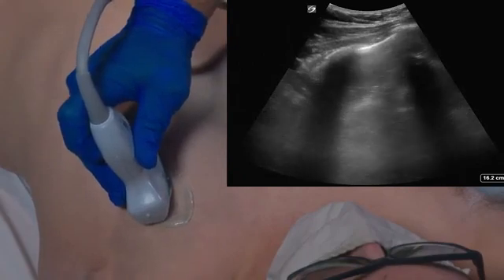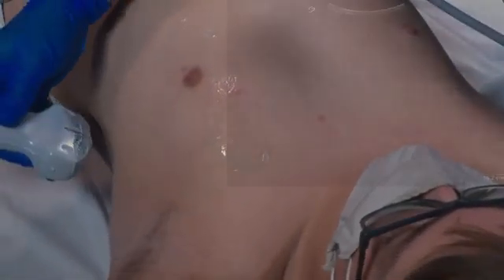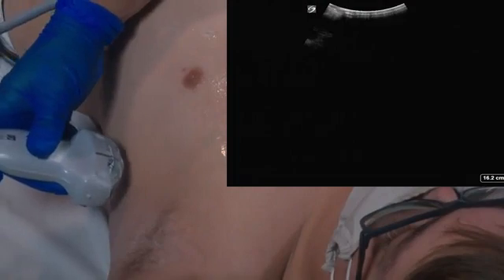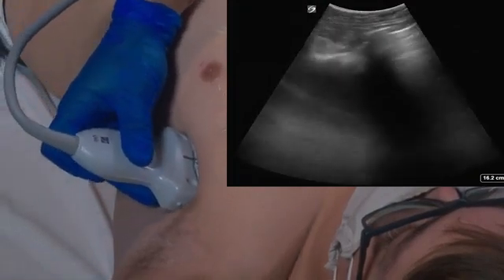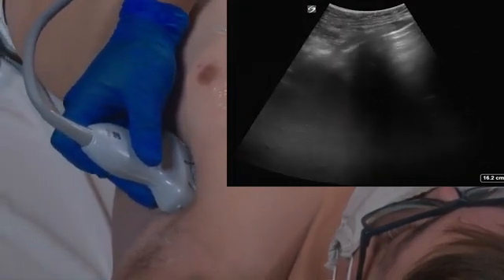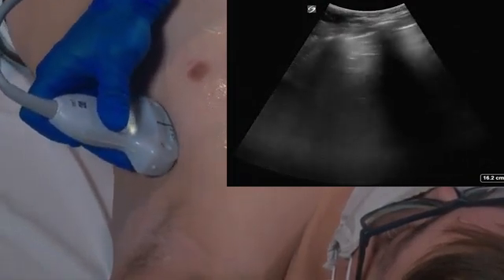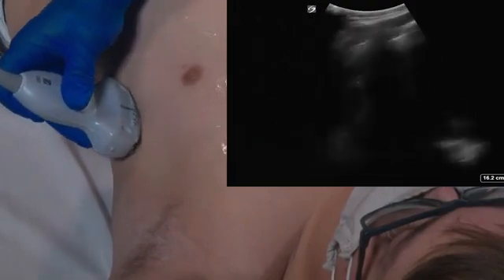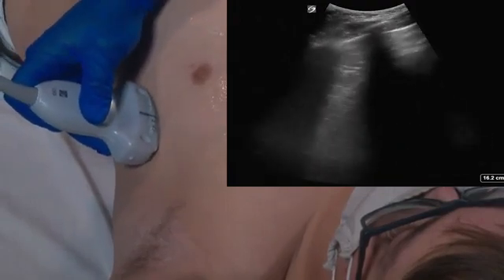Next, we're going to move into the lateral portion, which is between the anterior axillary line and the posterior axillary line. Again, we're going to image throughout this zone, looking for any evidence of B lines.